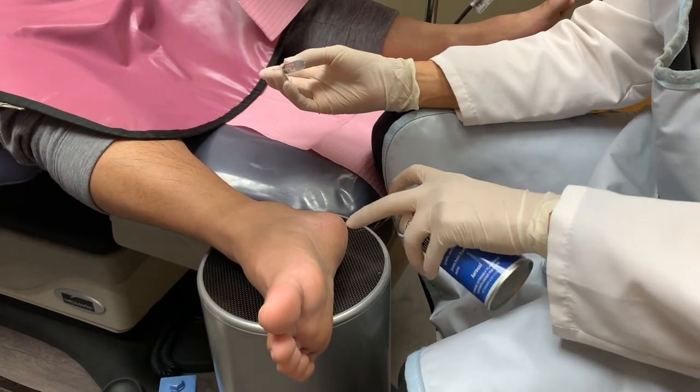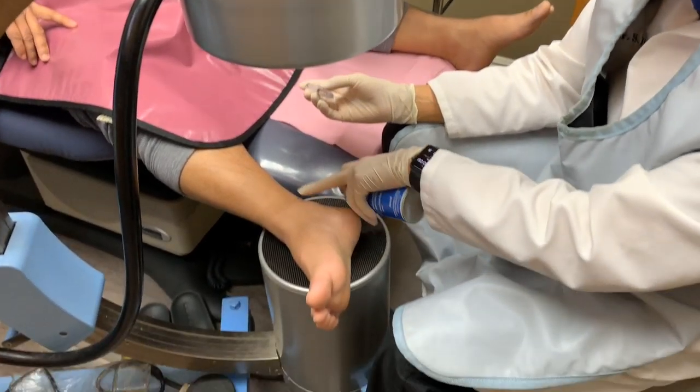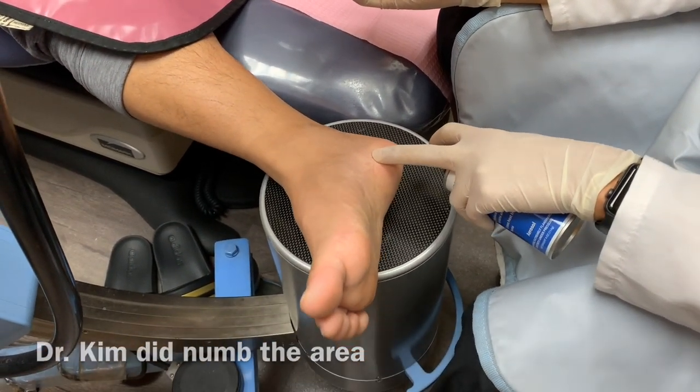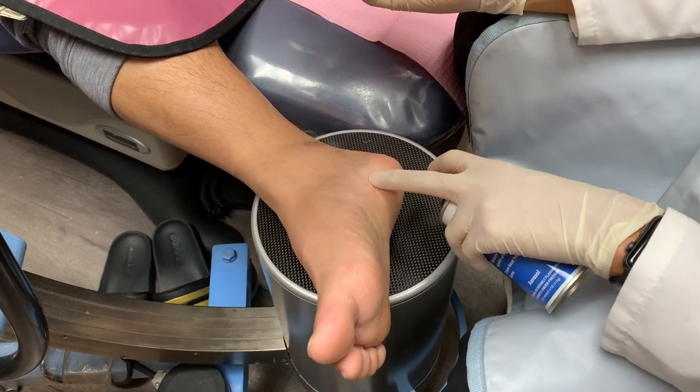So now I'm injecting the heel. I know basically where I need to inject — it's around this area. I already numbed the foot here, so this whole area is numb, so my patient Dennis won't feel it. You feel any of this Dennis? It's pretty numb? It's pretty numb, doctor.